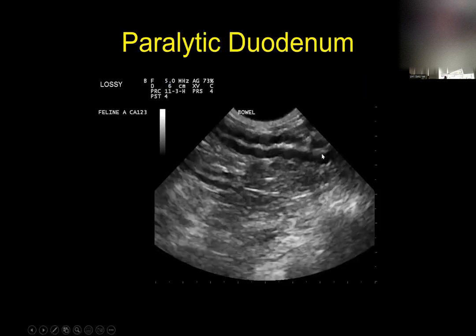The other thing sometimes we'll see, because the pancreas lives right next to the duodenum, and we haven't talked about GI yet, but we're going to, this is a piece of the duodenum, the small bowel. This whole thing right in here is the small bowel. And notice it's kind of curlicue. It's kind of corrugated in its appearance. It's not just a straight tube.